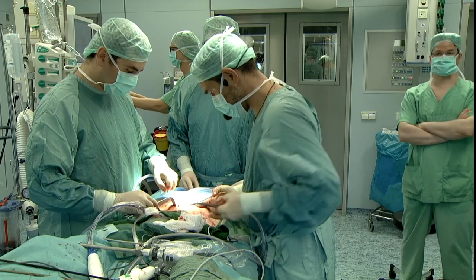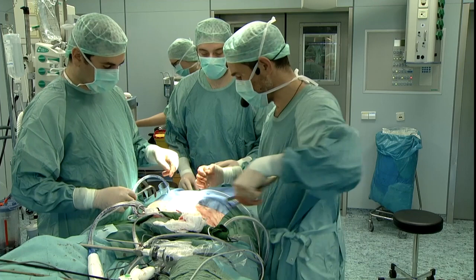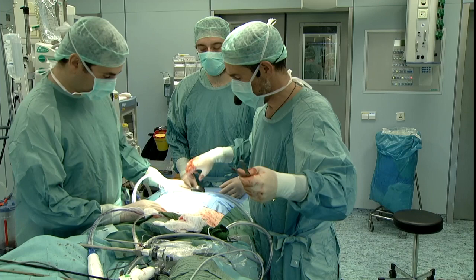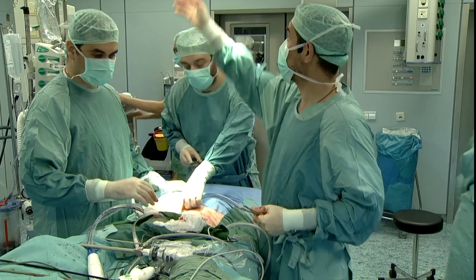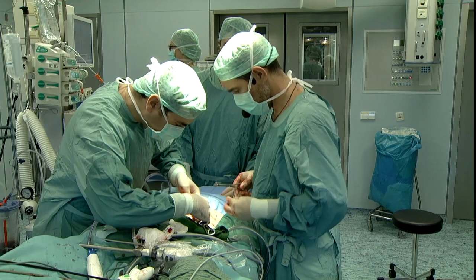So, any other comments or questions you would like to ask? Because we are suturing the skin now. Just let me know. Do you sometimes use Endoclose for closure of the trocar incisions? No, we just use a normal... we close a 12-millimeter trocar, cut, by the way. 12-millimeter trocar, and we use those UR6 needles, which are very good. So, Farabeuf? It's nice to see that you still close your own incisions. Always.